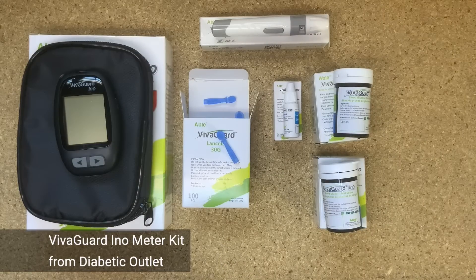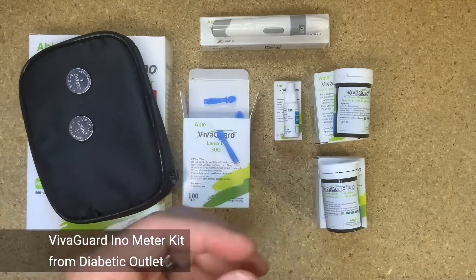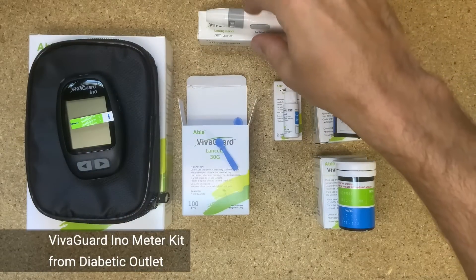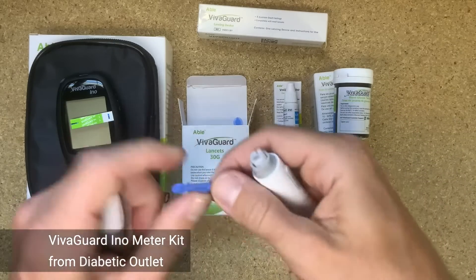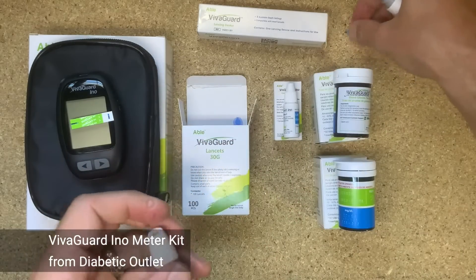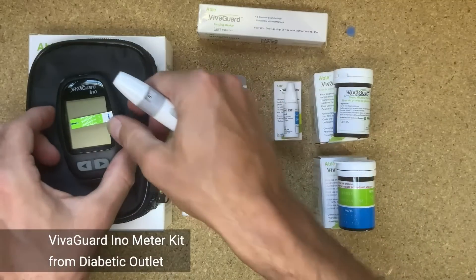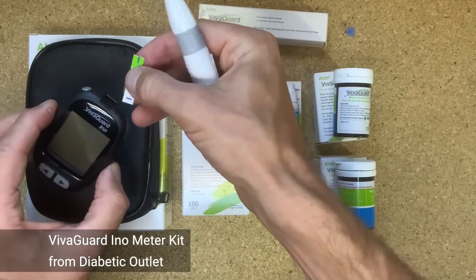Let's do a blood glucose test. We'll start by putting a lancet in the lancing device. And then we'll put the strip in the blood glucose meter, and we'll put it in the right way.